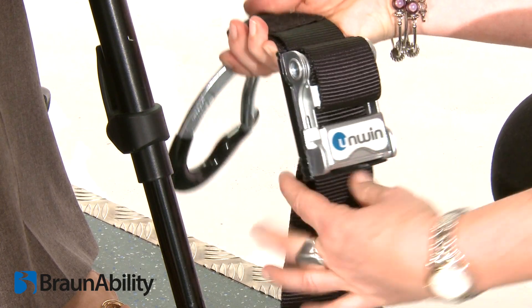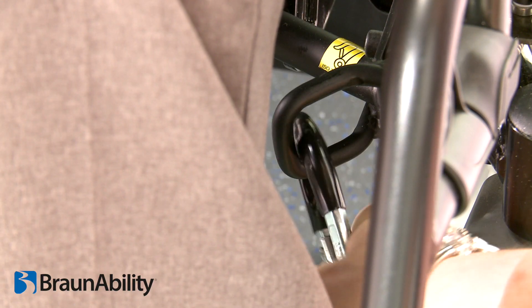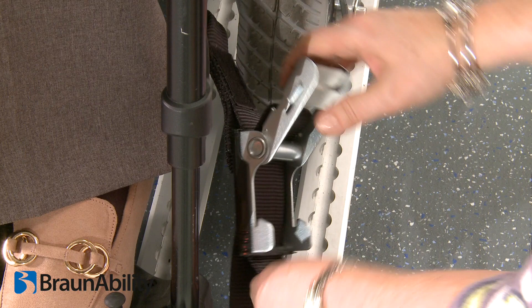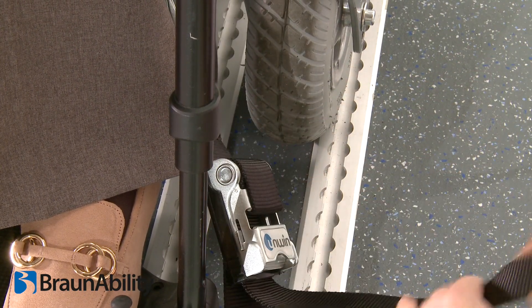Unfasten the Velcro and release the over-center tensioner. Pull the webbing and attach the carabiner to the designated front attachment point on the wheelchair frame. Pull the loose webbing until firm, then close the over-center tensioner using both hands and re-secure the Velcro fastening.